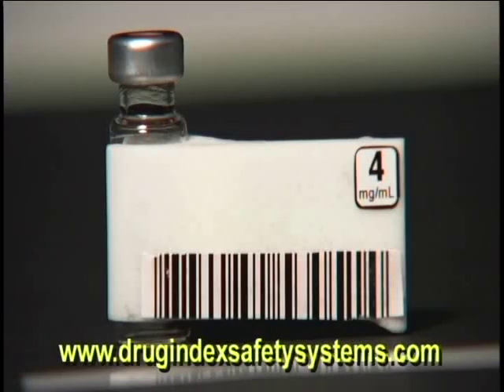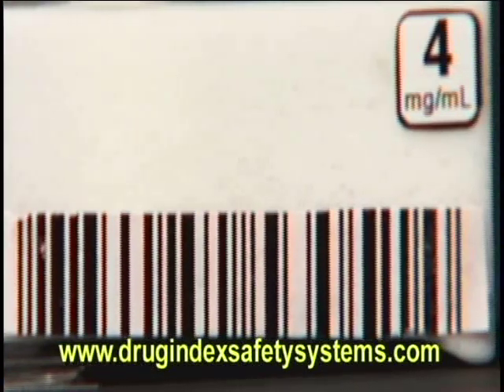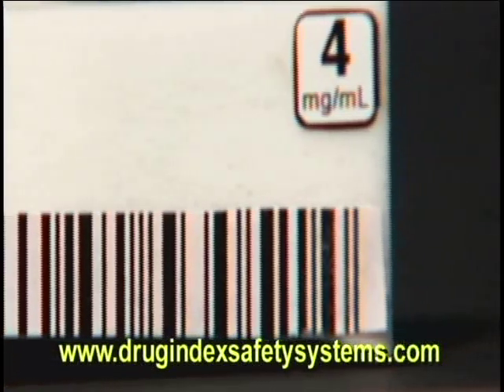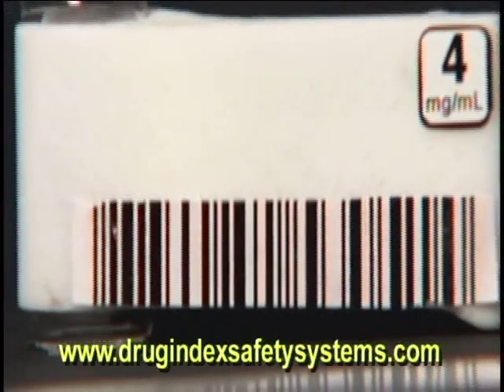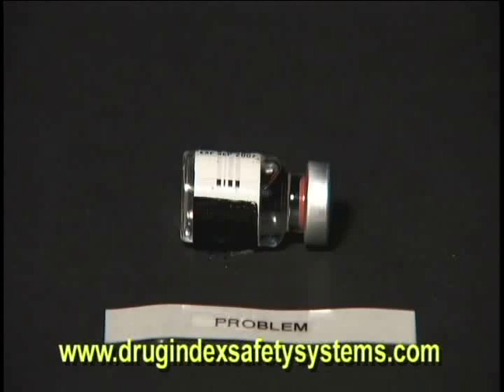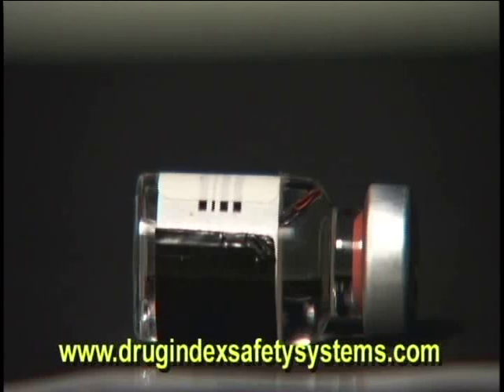Electronic patient record system software is a way to link patients to the drug about to be administered. These systems alert clinicians to possible dangerous drug interactions, reconcile the dosage of the drug ordered to that being administered, and verify the drug pedigree through barcode scanning. Many high-concentration pharmaceuticals are contained in extremely small, low-capacity vials and don't have the surface area required to contain enough bits of information. Even 2D barcoding and matrix stamps are limited on these products.